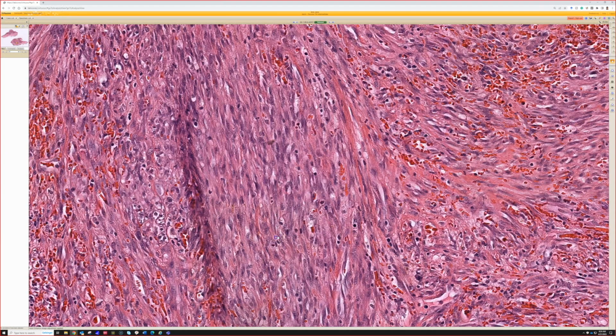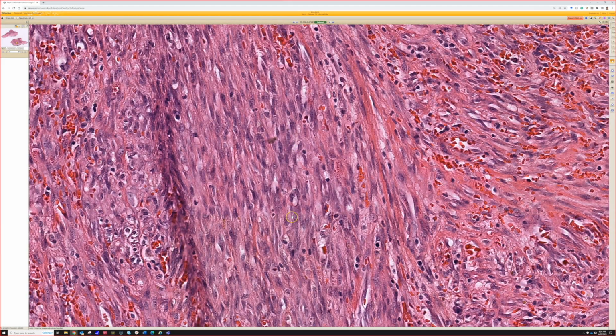So for example, here, there's fascicles of spindle cells. This is a poor quality H&E and scan, so we're kind of doubly hindered here. But they are kind of plump. They'll have mitoses, but usually they're not wildly pleomorphic. If you see a vascular tumor, even one that has slit-like spaces and blood, but looks super pleomorphic and ugly, you should think of spindled angiosarcoma before Kaposi.